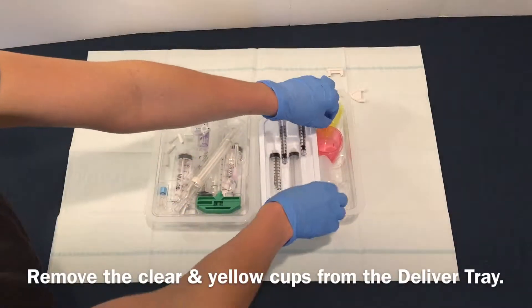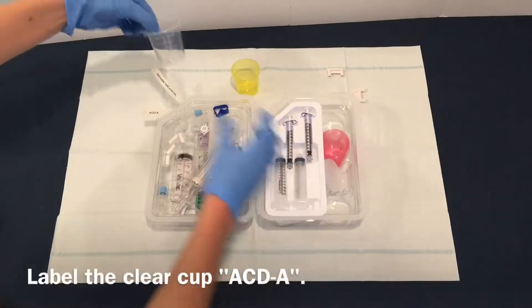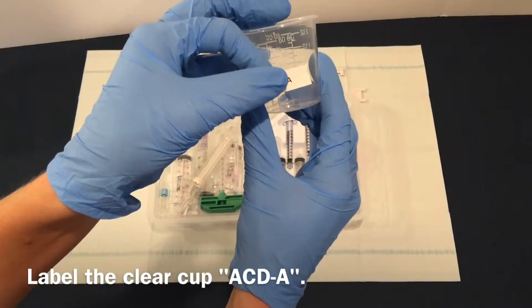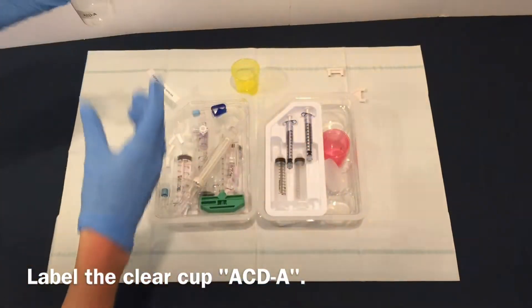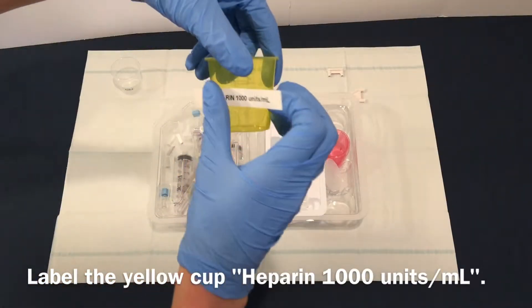Remove the clear and yellow cups from the Deliver tray. Label the clear cup ACDA. Label the yellow cup heparin 1000 units per mL.